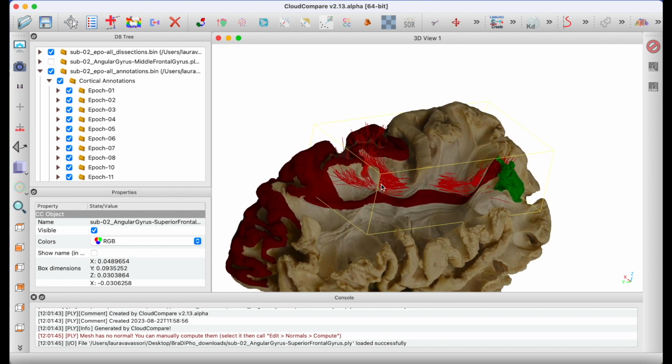How can I enhance the information that I need to have a better and more anatomically reliable representation of this connection? I'm leaving these questions open, but this was just to stress the fact that in some cases, BraDiPho might lead to a complete match between our tractography and the dissection data, but in other cases, we can also use the information that comes from ex vivo dissection to have a hint on what can be done better on the in vivo side.